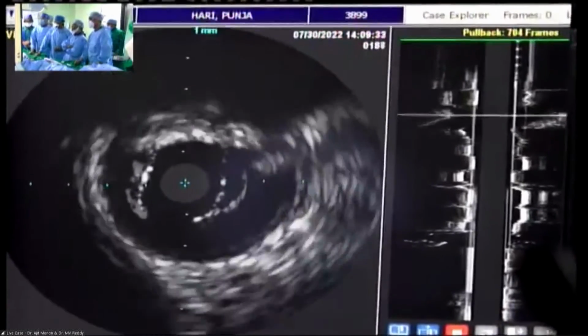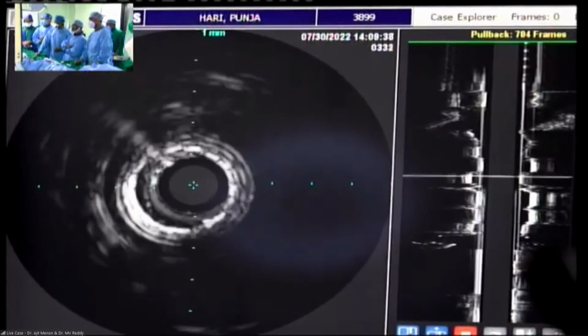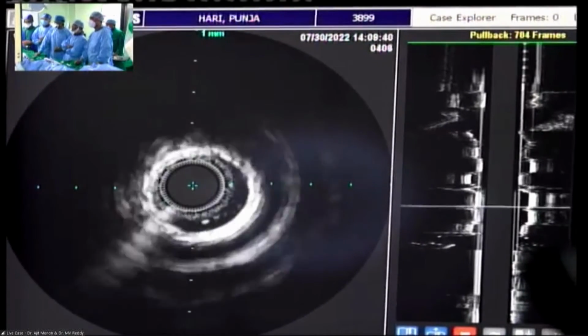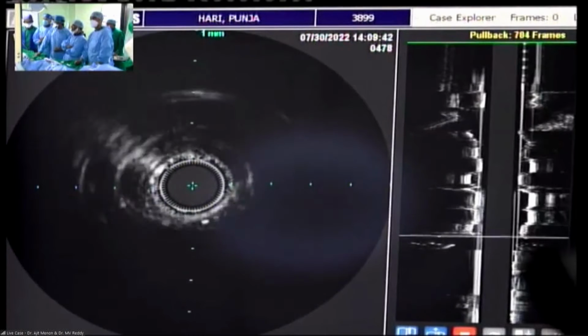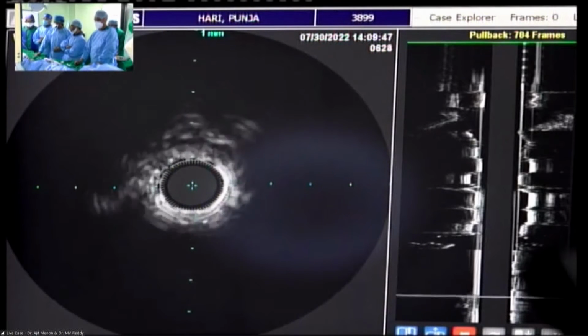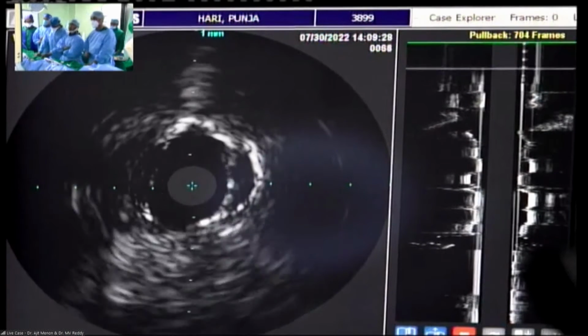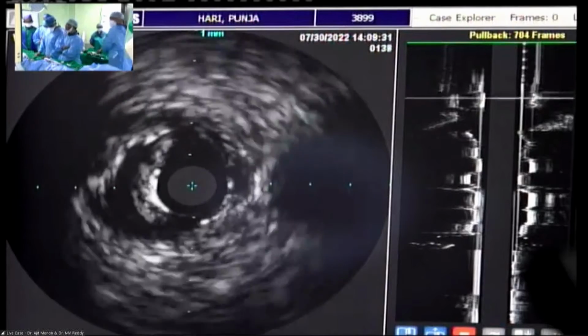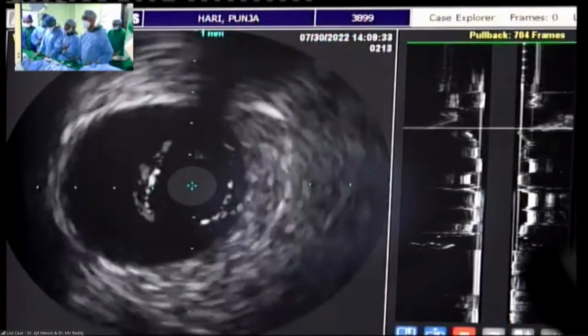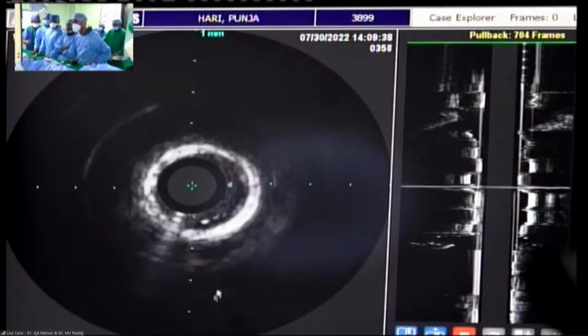I think possibly it's air in the diagonal. The diagonal is moderate caliber. I think something must have happened also. Maybe in the LAD we didn't see it, but the diagonal clearly was closed. Now that you got out of it, I would just fix that proximal LAD since it's tight. Obviously, your IVUS and OCT are not crossing. OCT would not show. I wouldn't go beyond that bifurcation. I would be very, very careful that I fix only the proximal LAD. That's the only thing that I'm planning to do.